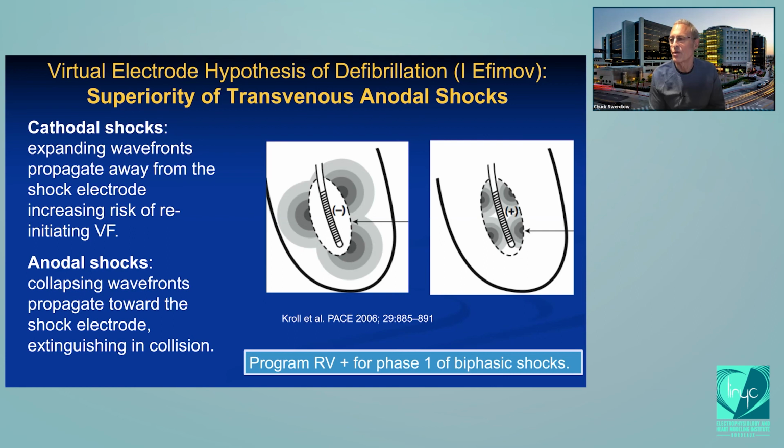So this is much more than you wanted to hear, but basically, yes. My own personal view is, and Sylvain knows me pretty well, I'm not categorical about a lot of things. There is no scientific justification for programming a cathodal shock.